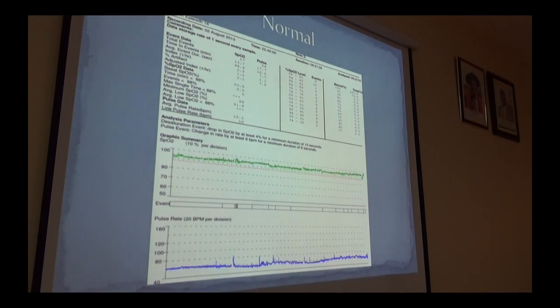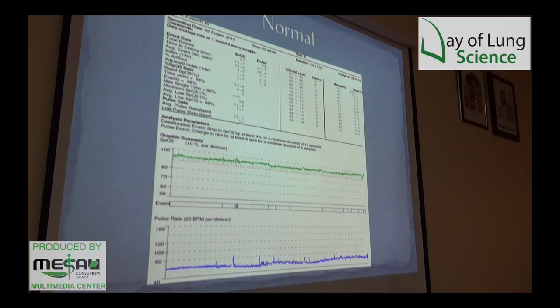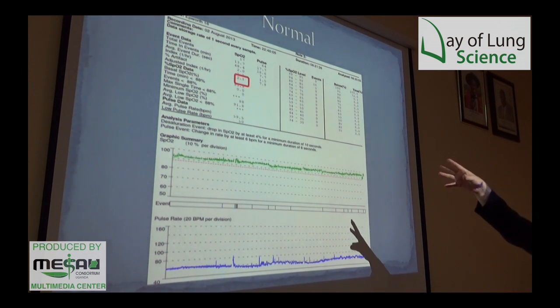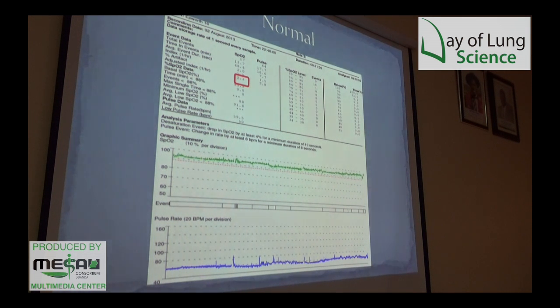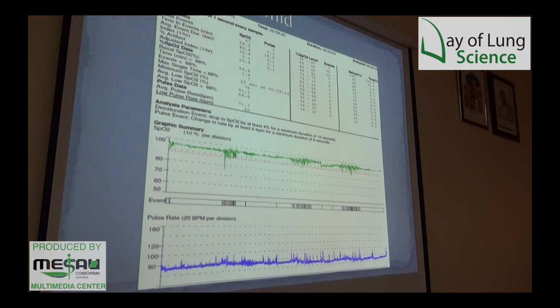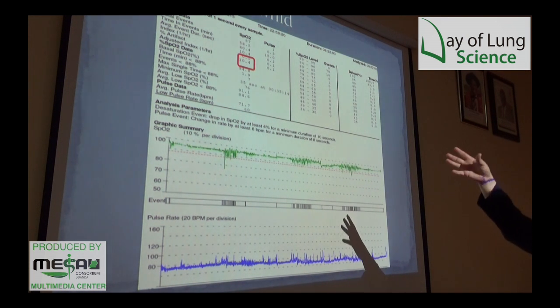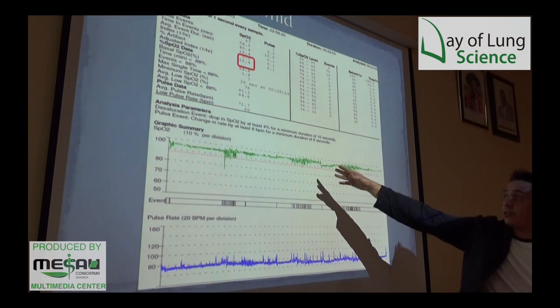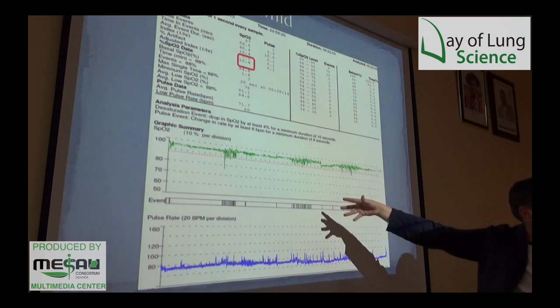Starting with pulse oximetry — this is a normal trace. The highlighted box shows the apnea index: we look at how many desaturations of 10 seconds or more per hour of sleep, and that is 2.1 — anything less than 5 per hour is normal. For mild apnea we have an index of 10, and you can see some dips in the oxygen saturations where the apneas occur.